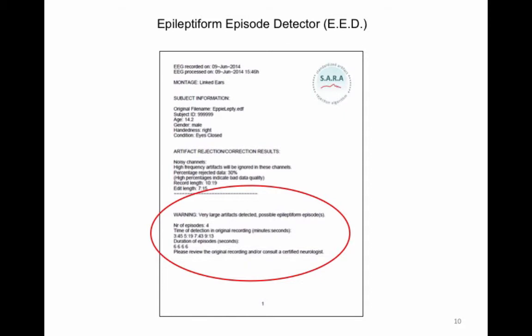The number of episodes is shown, as well as the time of detection in the original recording and the duration of these episodes. It is advised to review the original recording and/or consult a certified neurologist.